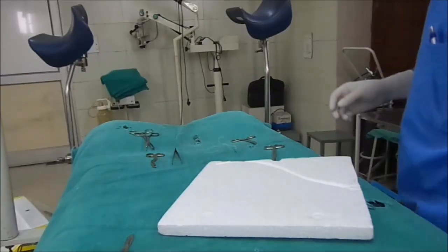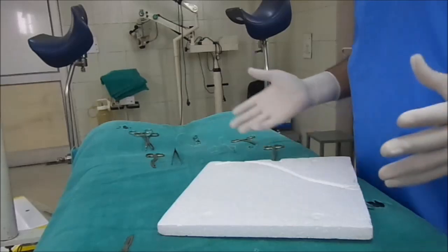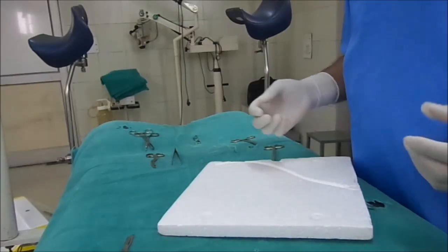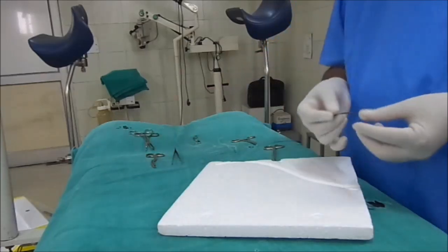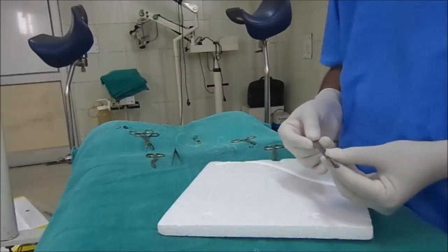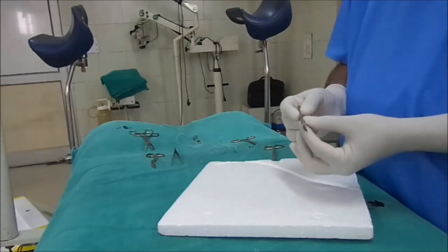Hi friends, I am going to demonstrate a few basic surgical techniques. The very first is how to hold the scalpel while making an incision.